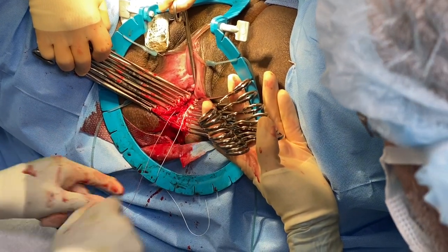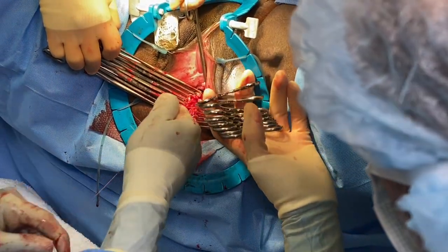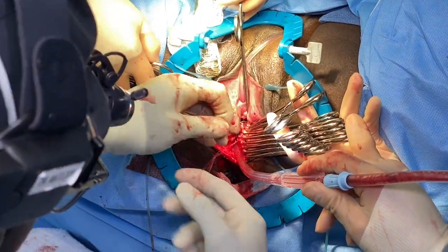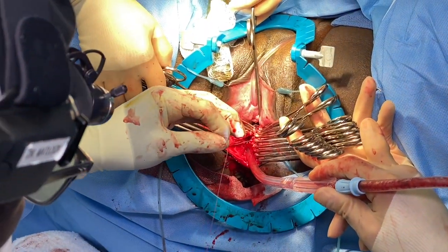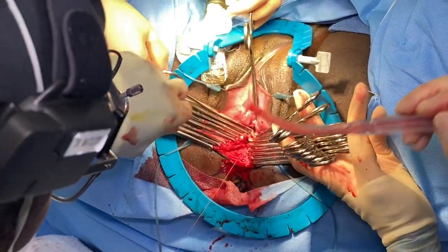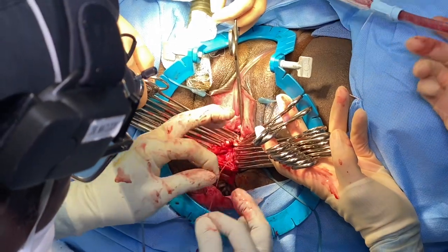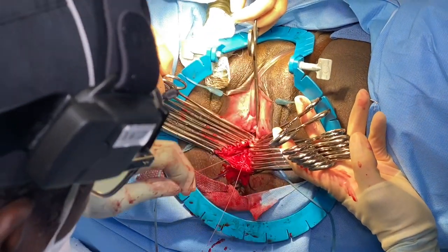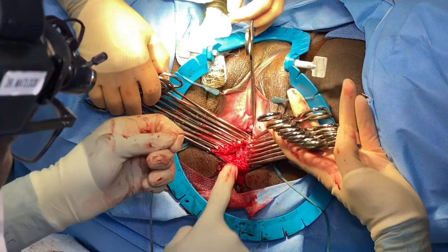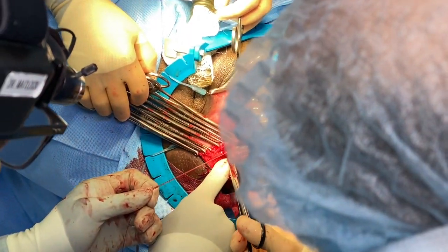Stitch, I'm going to tie this, bring you back in. Bring the muscles back together. Levator ani muscles, very important support muscles of the pelvic floor. They will heal together. Her goal was to be as if she never had children.